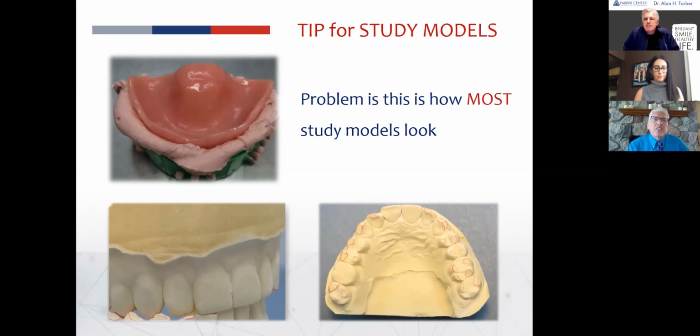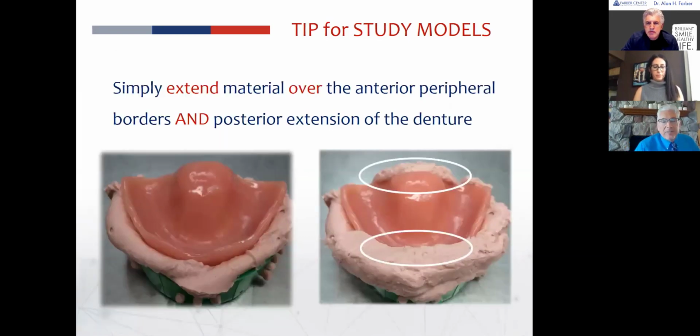So study models are lacking many times because what you see here on the two images on the left is very common. Well, the dental assistant takes the patient's existing denture and puts it into an alginate tray. And when they seat it like this, we see the arrangement, the mold of the teeth. Then you look from the occlusal, but many times we don't see the palatal area. It just does because of the vault to the palate here. So what happens is we lose data, information.